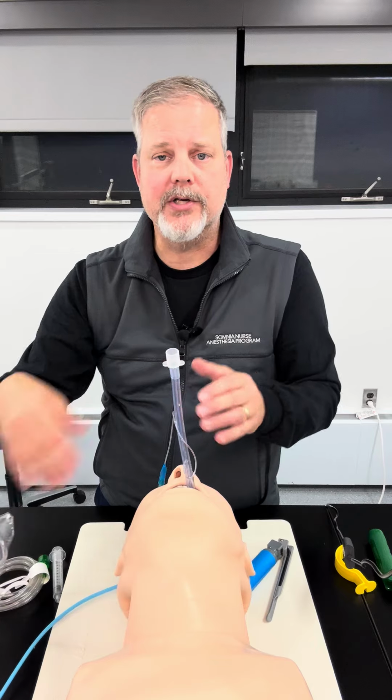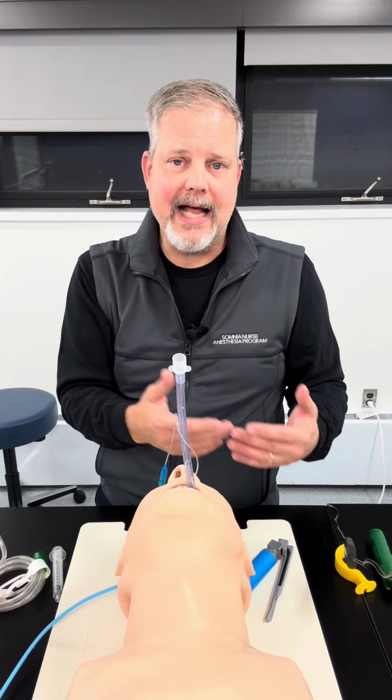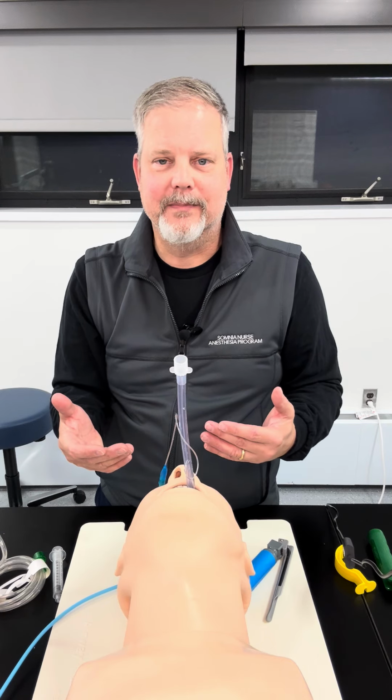So I hope this helped you understand a little bit more about using a different device to help guide insertion of the endotracheal tube. So thanks for following me.